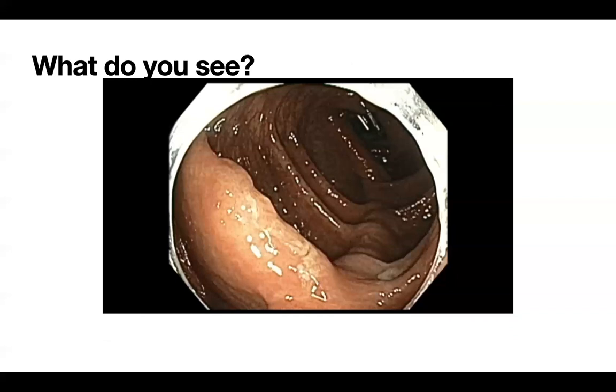And suppose such a patient is referred to you, the patient is referred to you for management of this big polyp. But at the same time, what is not mentioned, what is implied, is also that you will take care of the rest of the polyps if there are any, which means that the screening of the rest of the colon falls on the second endoscopist.